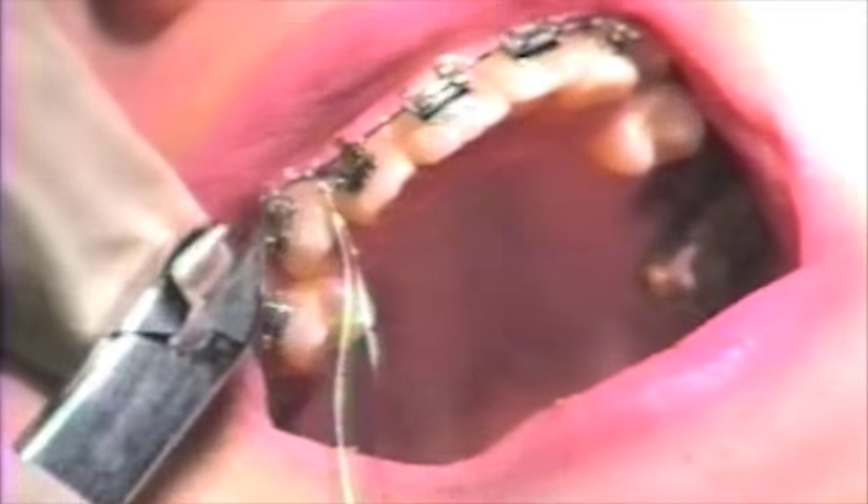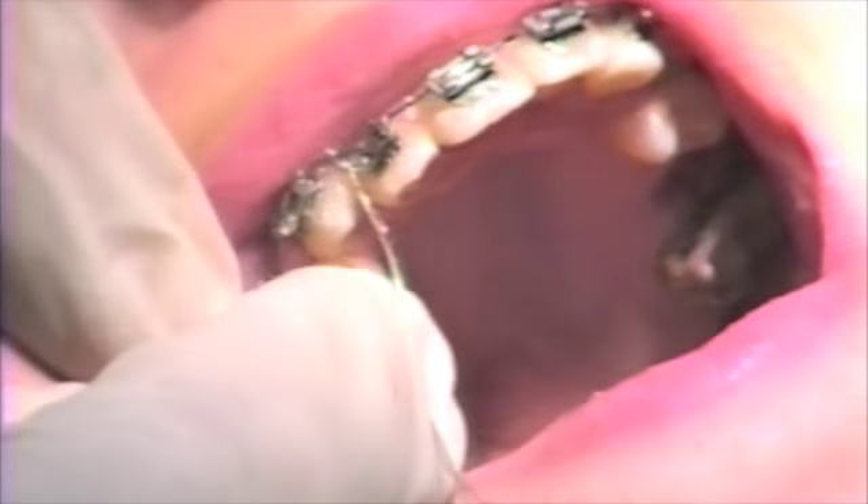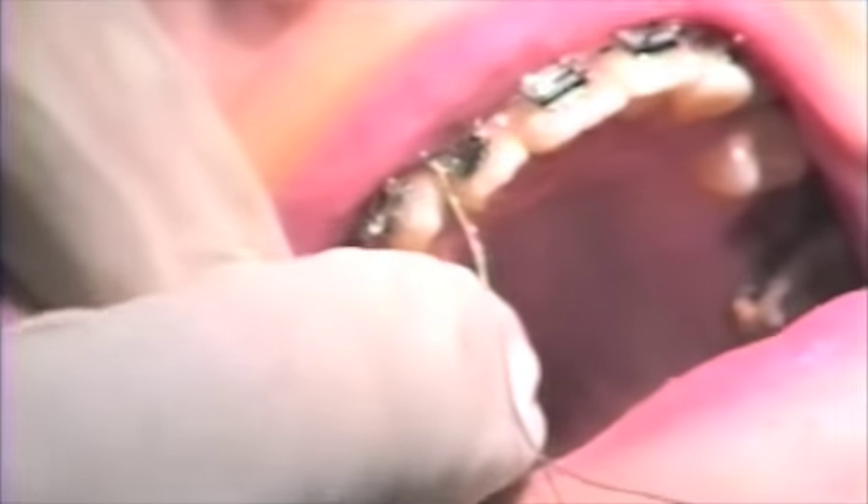A pin ligature cutter is used to cut the pigtail, leaving 2-3 mm of wire to be tucked underneath the bracket.